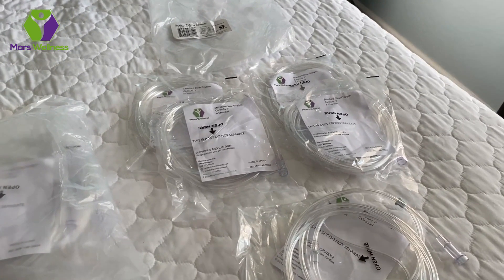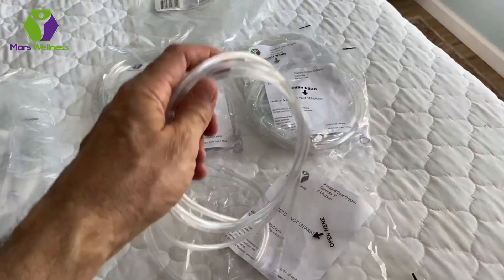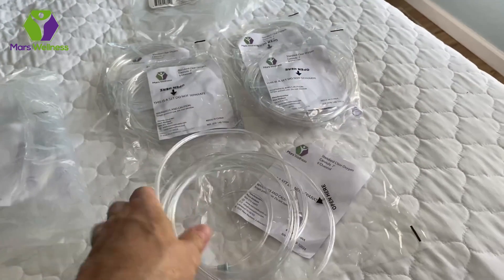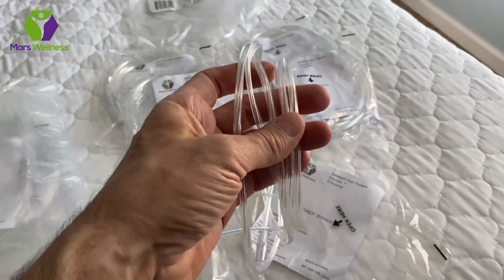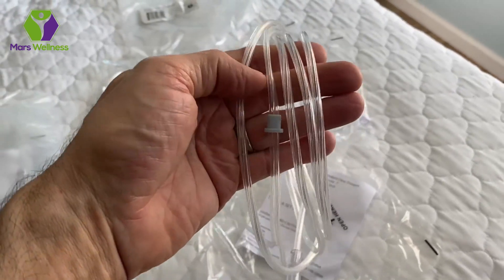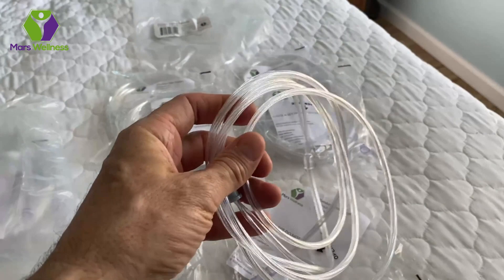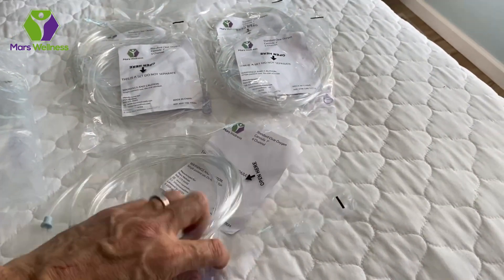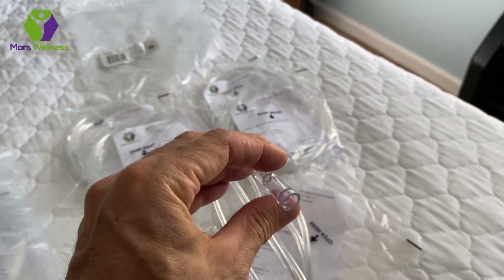These are individually packed for single use. It is very lightweight, and they're kink resistant, so as you are using these, they should not kink up and have oxygen stop flowing because of the tube. This is made of hospital-grade plastic, and it's clear so you can see inside if anything gets in there. And it has the universal connector, which should universally fit everything you need. If you have different apparatus, this should work for you.